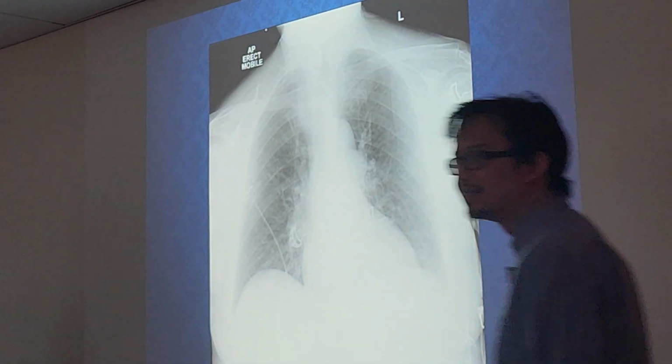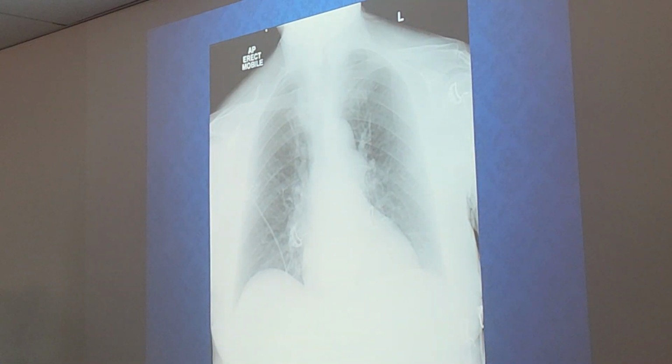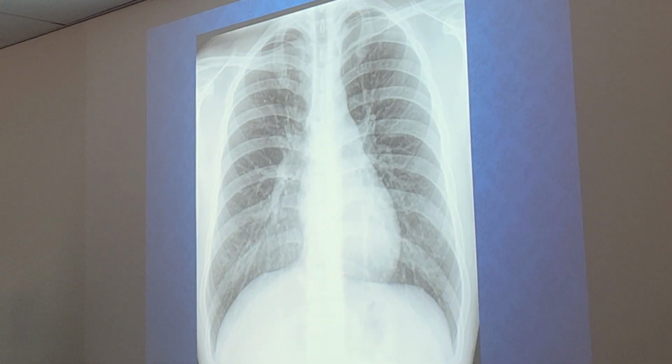I think Samantha had a question. Yes. So just for PA: clavicles below the apices, unlike AP. Ribs are curved inward toward the ends. The gastric bubble, well, I guess on the left. Heart shadow on the left. It's less magnified than if it was AP. Yes. Scapula border is not in the lungs from the chicken wings.